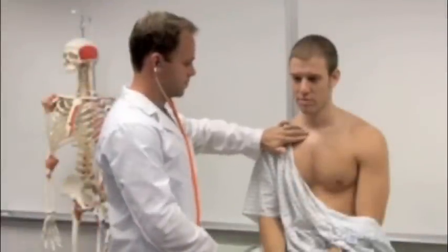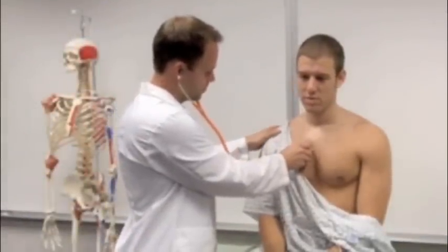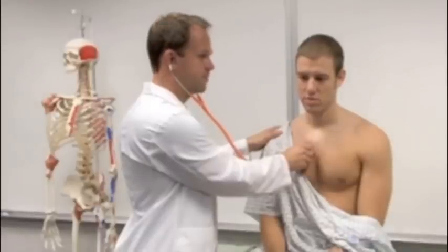First, locate the aortic valve. Palpate the 2nd intercostal space of the right sternal border, assessed for rate, rhythm, valve function, and anatomical defects.